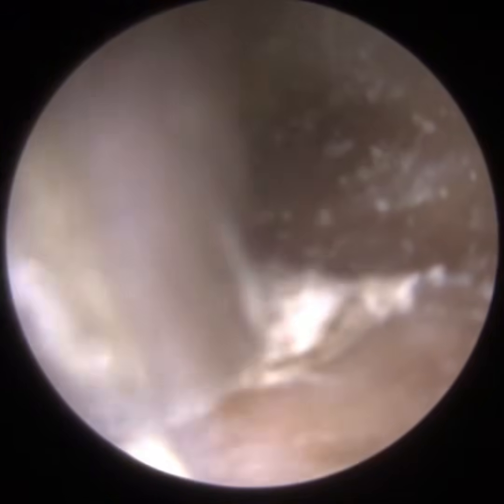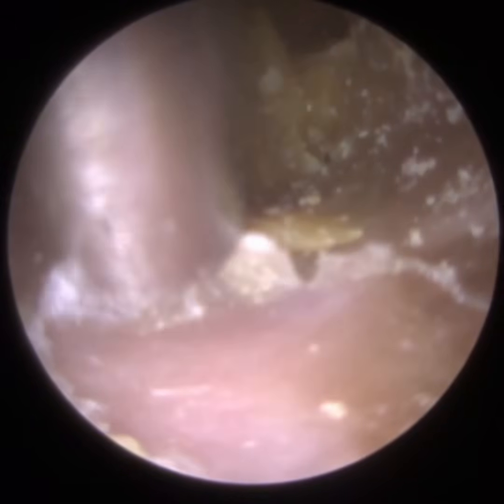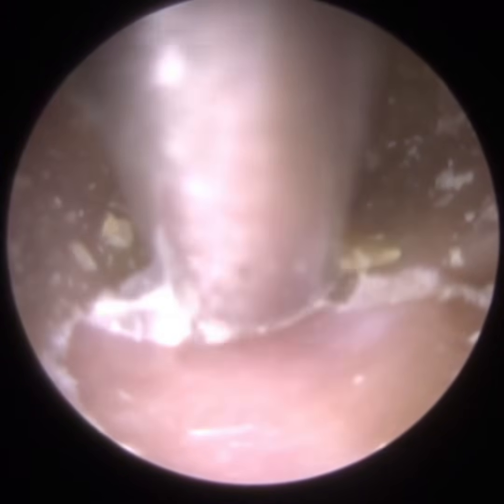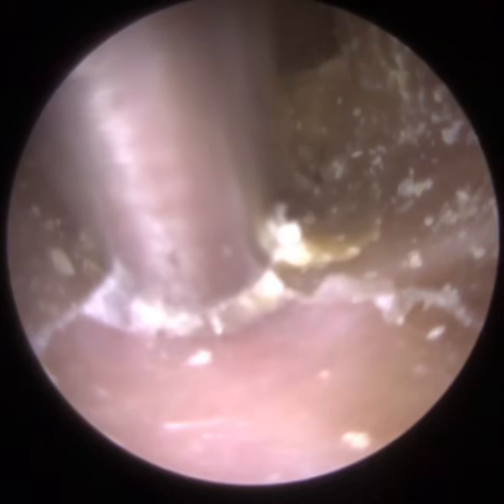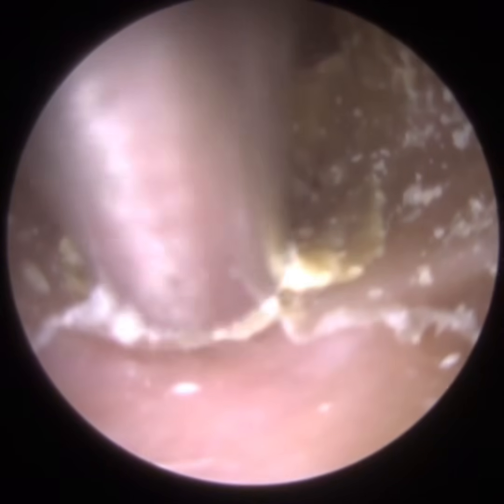And the issue with the patient's ear canal is that the skin dies on the ear canal and also the outermost layer of the eardrum, because the outermost layer of the eardrum is composed of the same skin that lines the inner two-thirds of the ear canal. In most people this skin would naturally migrate sideways and out of the ear. In this particular patient, this skin doesn't, and it just remains attached to the ear canal and eardrum. And you can see here the skin has become really hard and crusted.